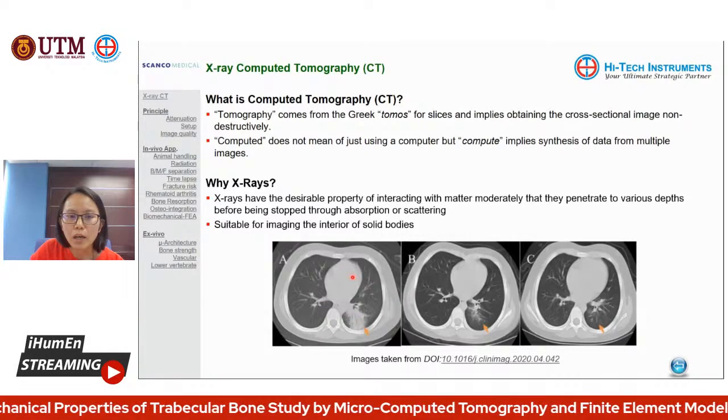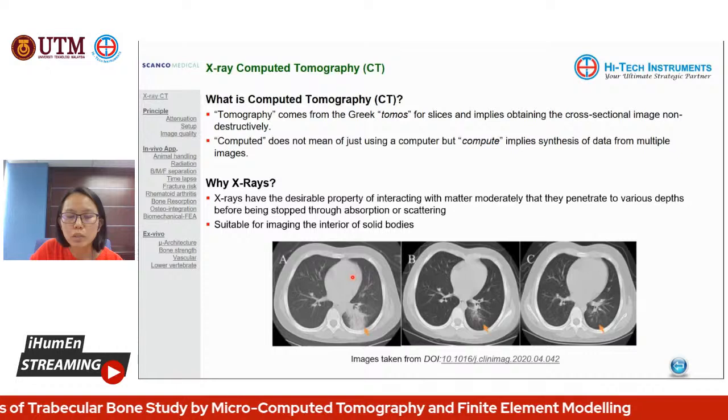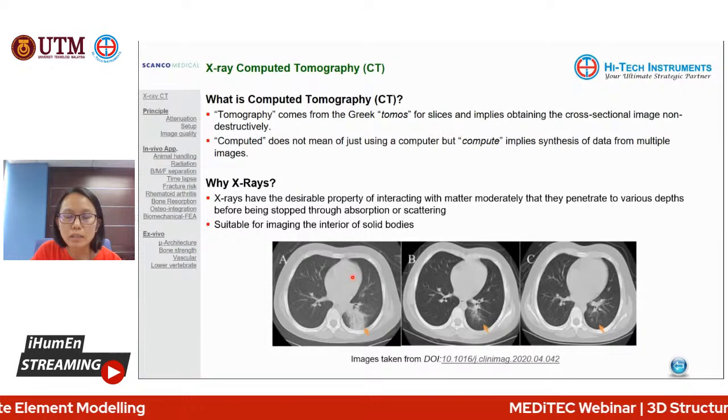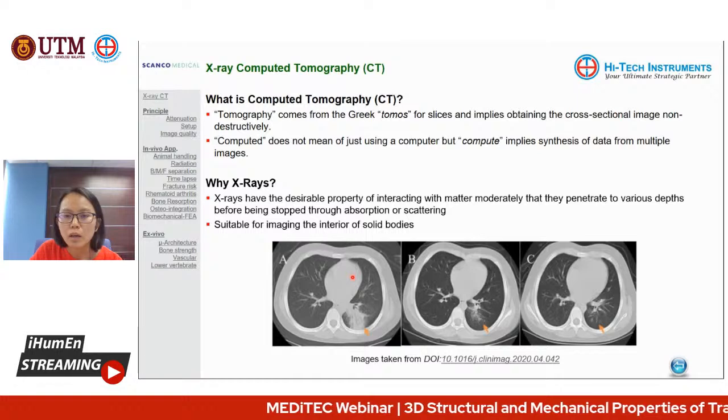This is when the CT was captured at the peak, when this 7-year-old had been diagnosed with COVID and displayed the most severe symptoms of difficulty in breathing.